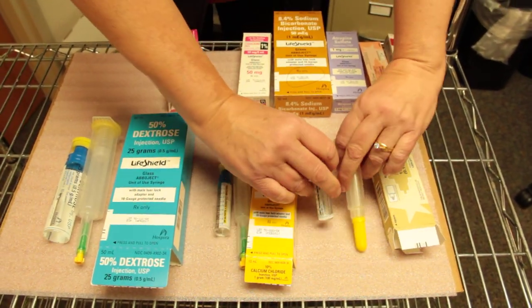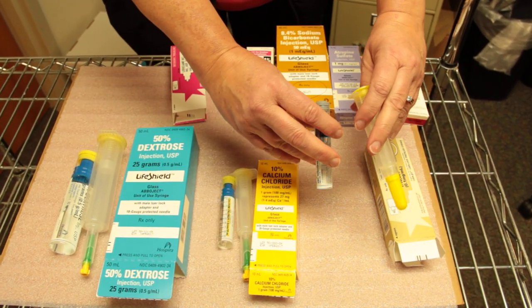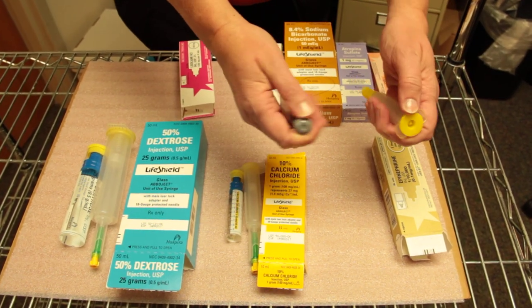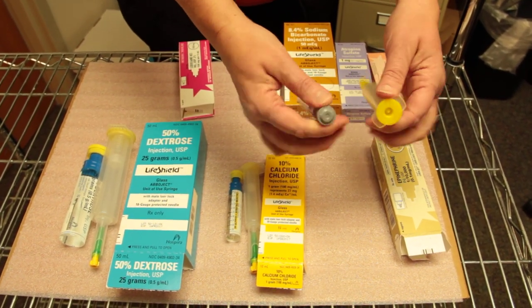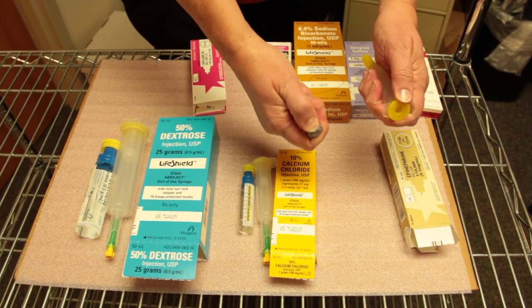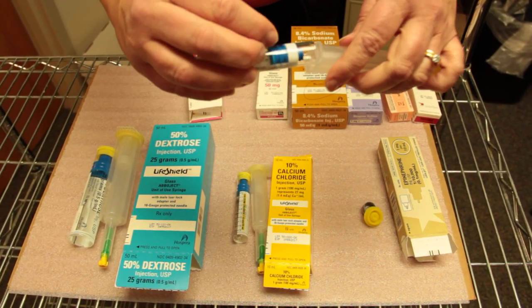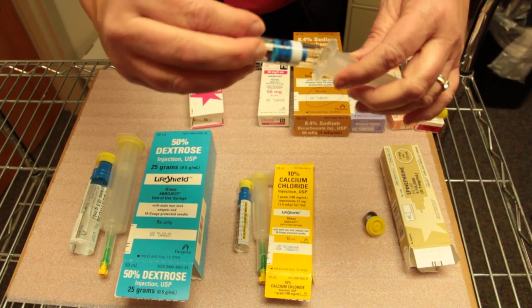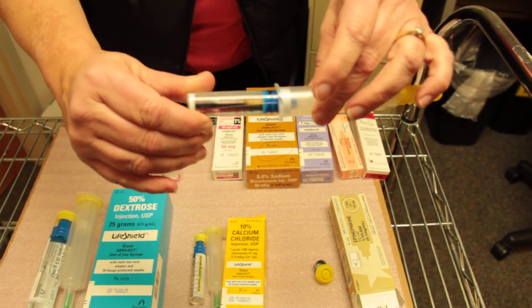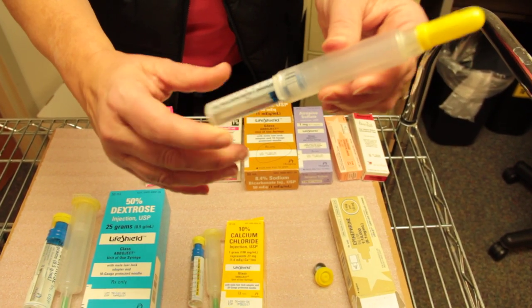On these emergency syringes there are a couple different types and how to assemble them is pretty simple. All of the emergency syringes come with two pieces. You have to flip the tops off just gently like that, and then you attach the two pieces together — they fit inside each other — and then you just gently do a little twist until they're attached.